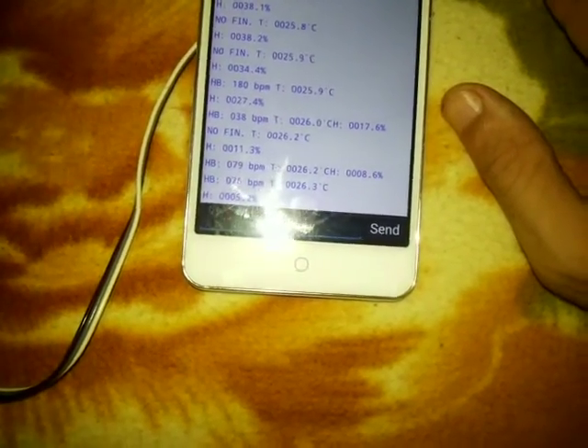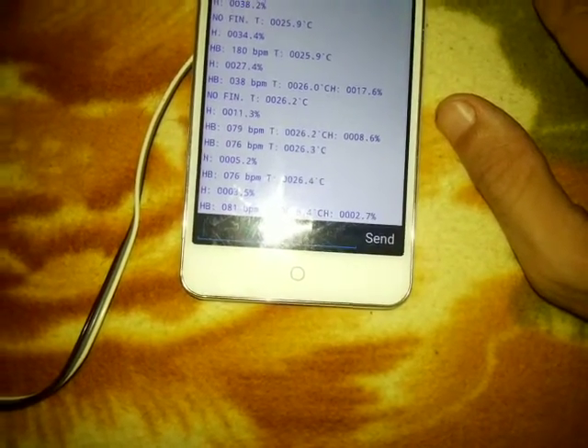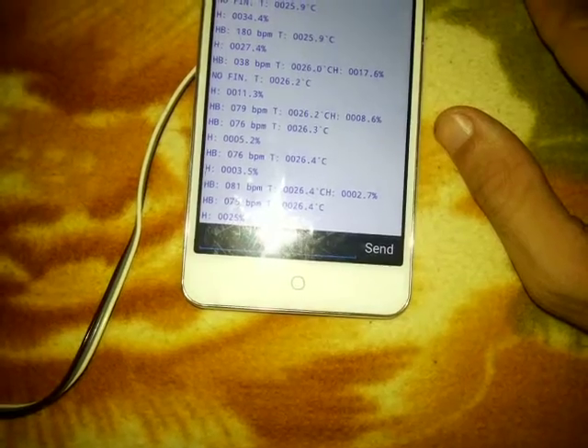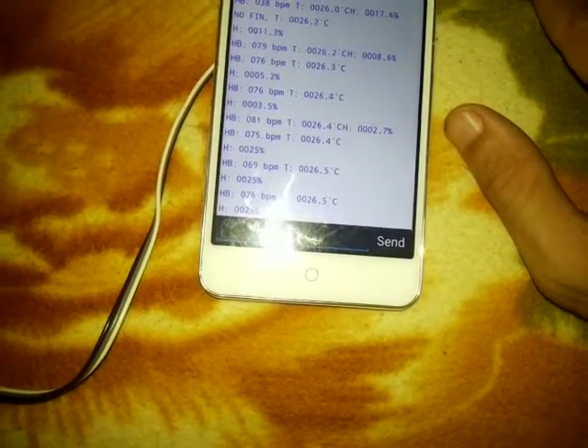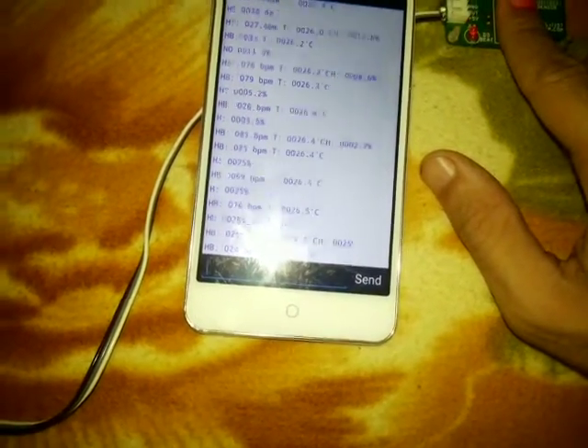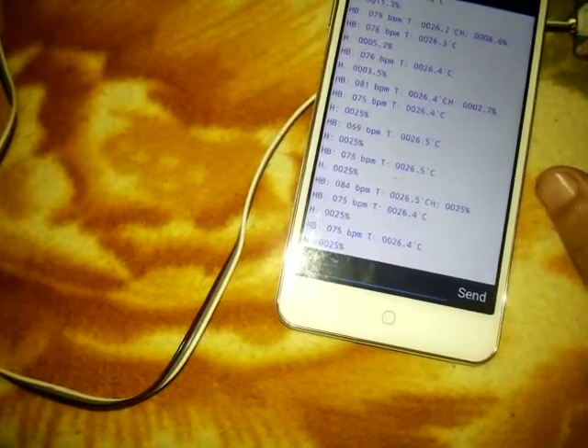Next we'll check the heartbeat. It's displaying 79, 76 because we are taking the data at every second. In this way our system is working, giving regular data. This is all about the project — thank you.